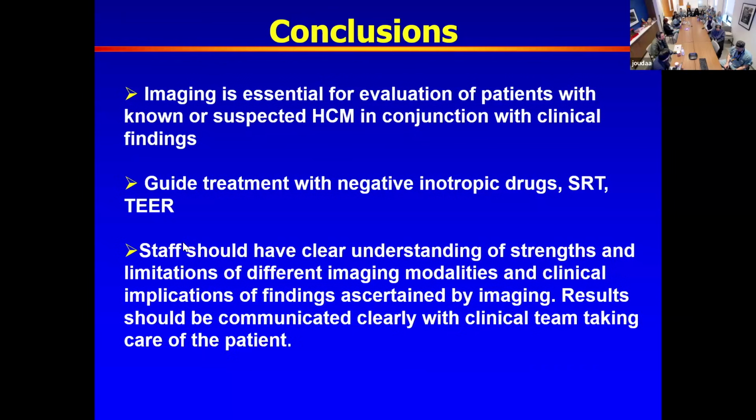So another imaging tip that's often challenging is distinguishing mitral regurgitation from left ventricular outflow tract. Do you have any practical imaging tips for our sonographers and us to tell one from the other?